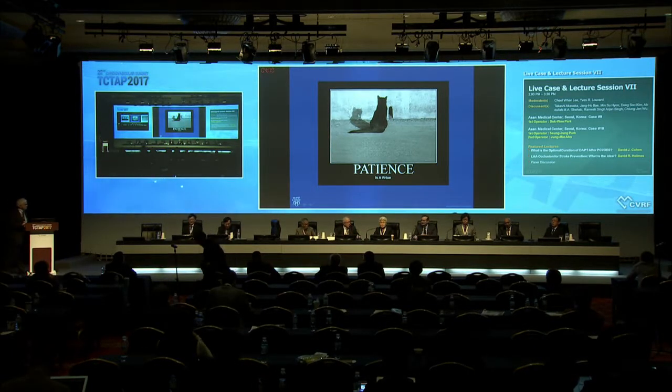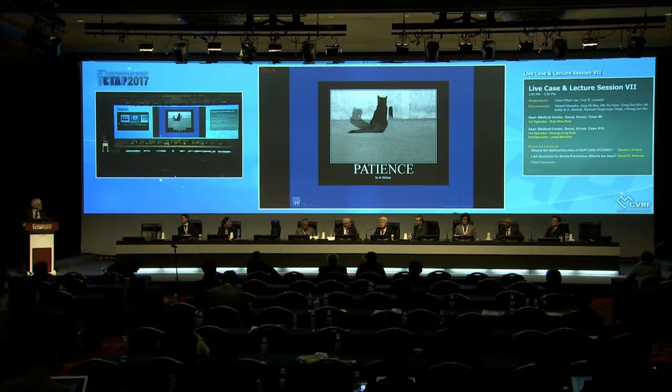Any question for David Holmes? What's the guideline status for the recommendation of this now? Pardon? The guidelines, what the guidelines say about the recommendation of Watchman or the devices now? Oh, the guidelines. Depends upon whether you live in Europe or whether you live in the United States.